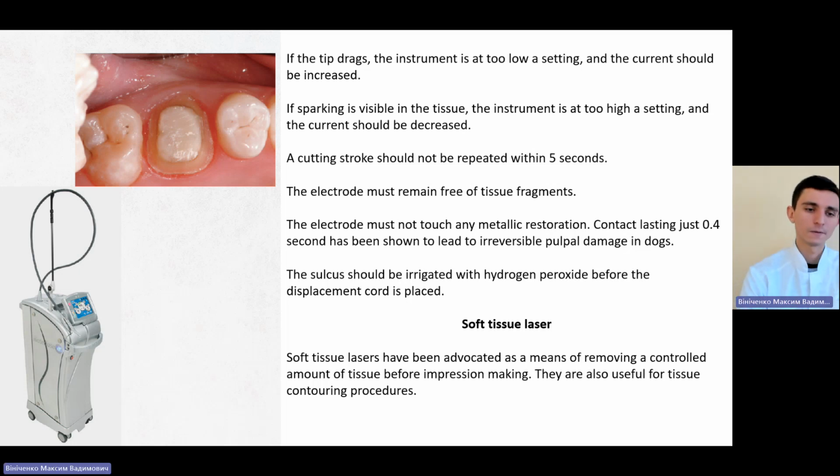There is also a soft tissue laser. Soft tissue lasers have been advocated as a means of removing a controlled amount of tissue before impression making. They are also useful for tissue contouring procedures.